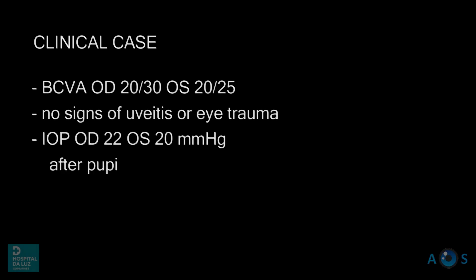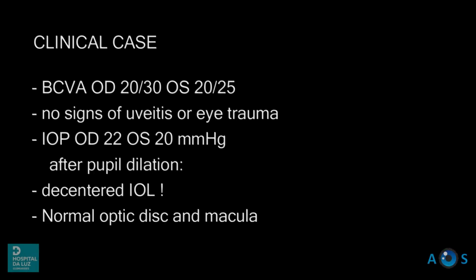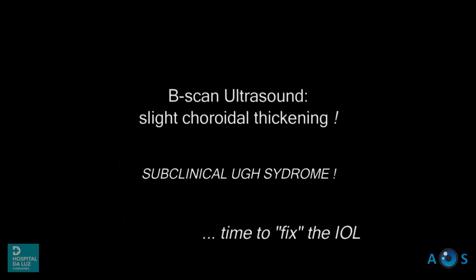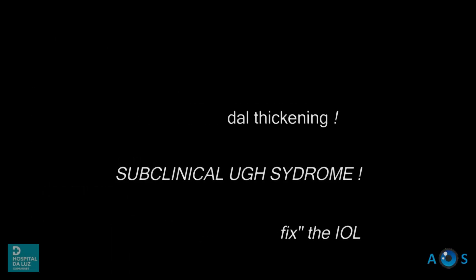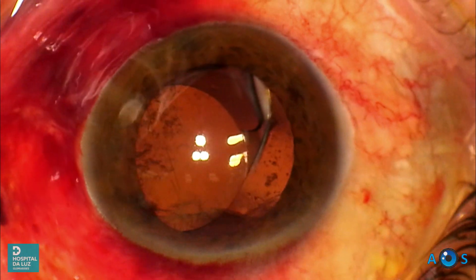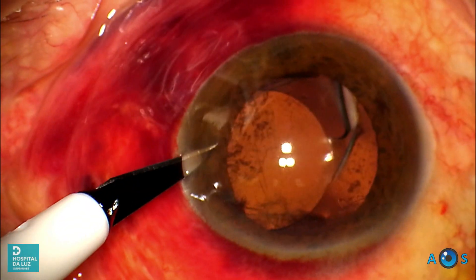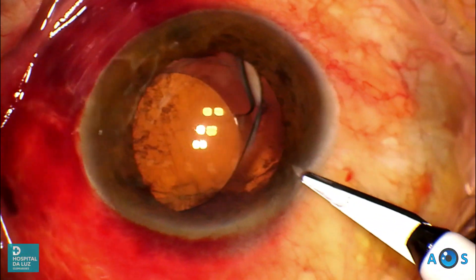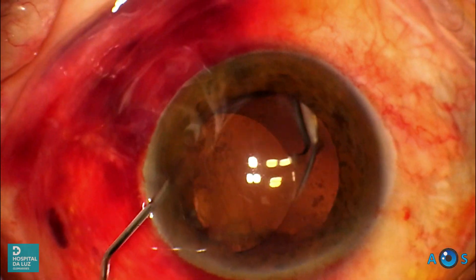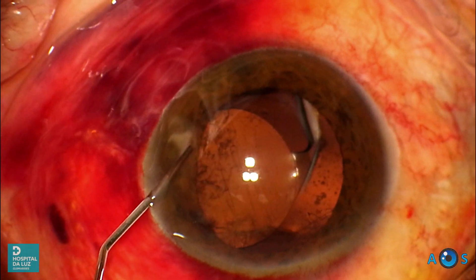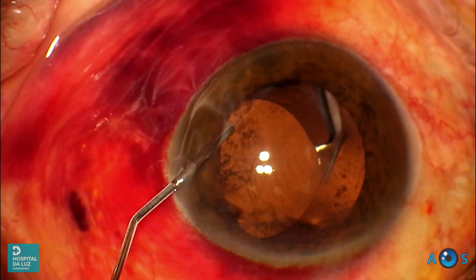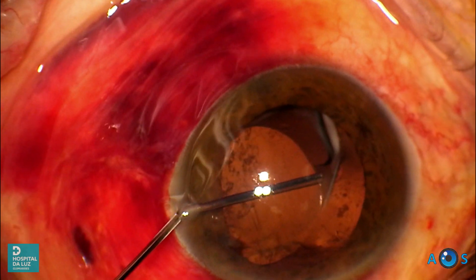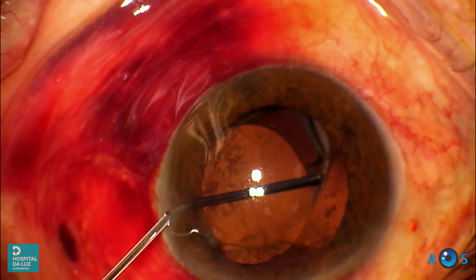The patient had not noticed visual acuity loss and no intraocular inflammation was apparent. However, B-scan ultrasound indicated slight choroidal thickening suggestive of uveal inflammation, therefore the misplaced IOL had to be addressed.